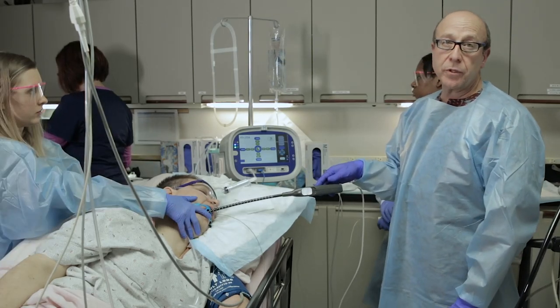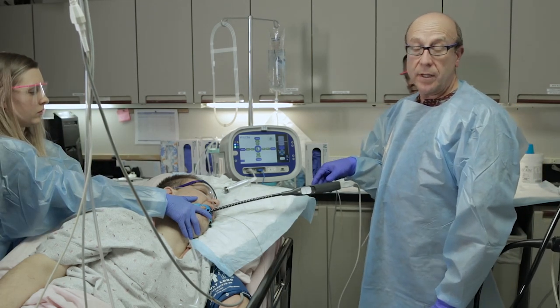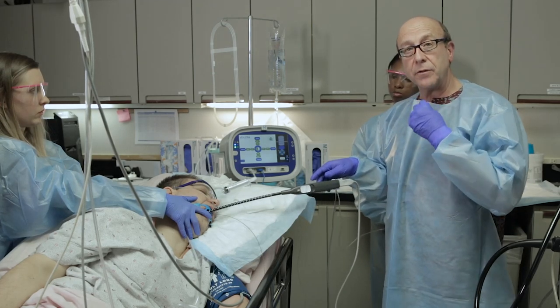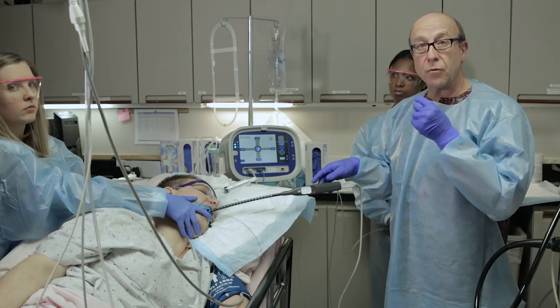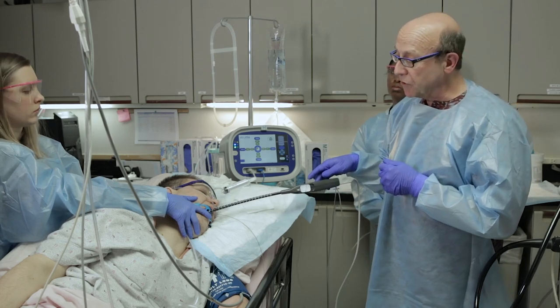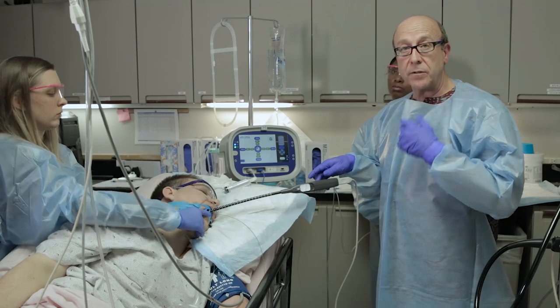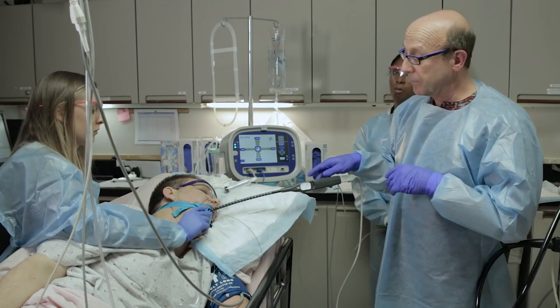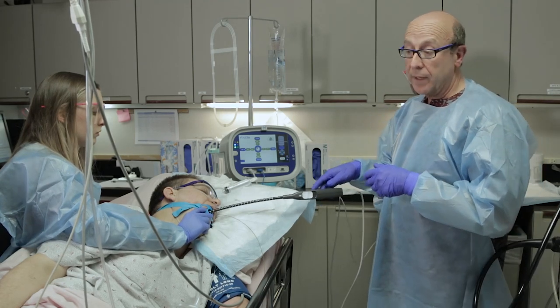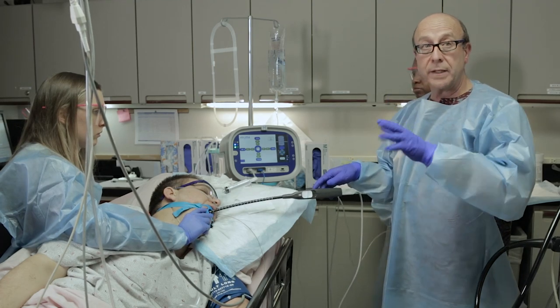The type of anesthesia we use is moderate conscious sedation. We want the patient maintained at a level where, if any fluid comes into their throat, they could sense it and either cough or swallow — this avoids aspiration. If the patient is too deeply asleep and fluid enters the throat, they will breathe it into their lungs without being aware, which can lead to aspiration pneumonia. So the role of the anesthesia person is very key — to maintain that perfect balance of awake and asleep.